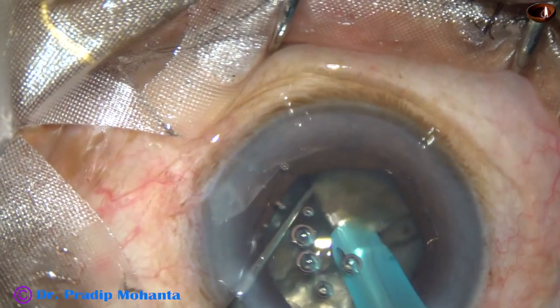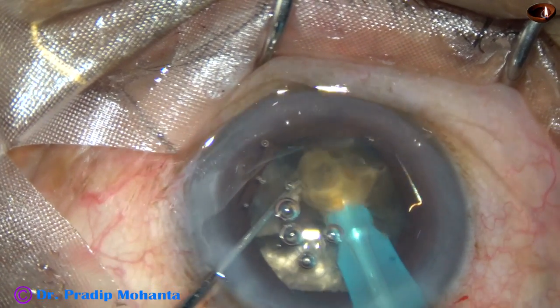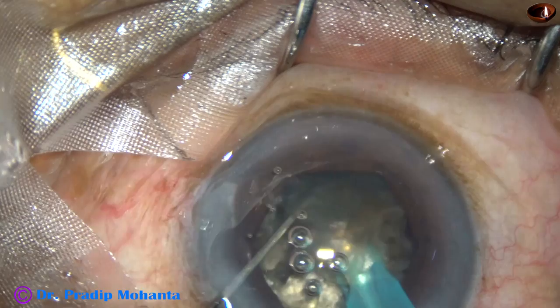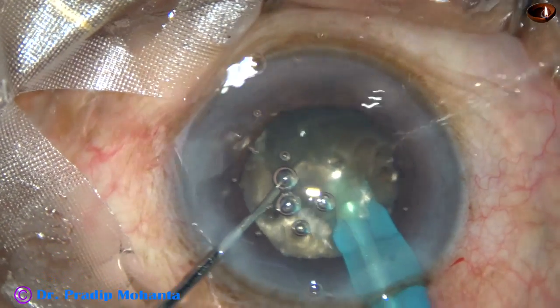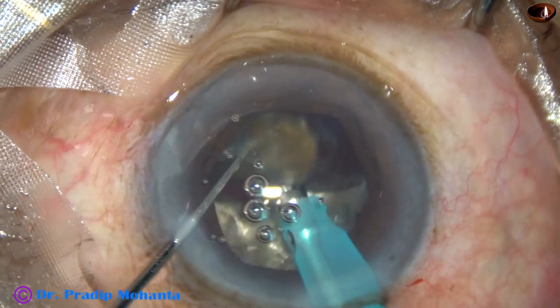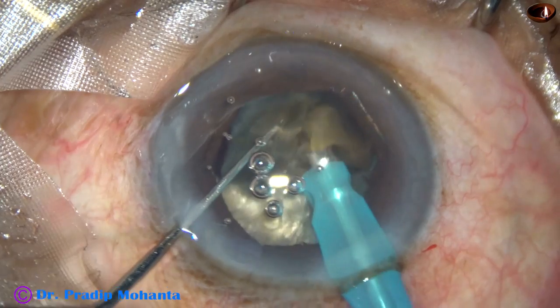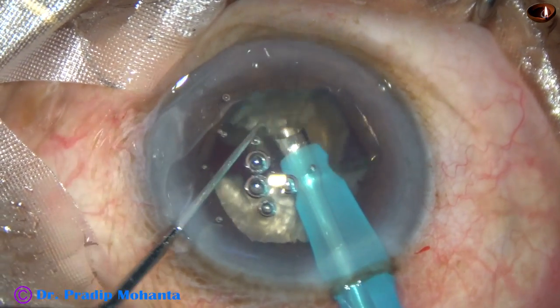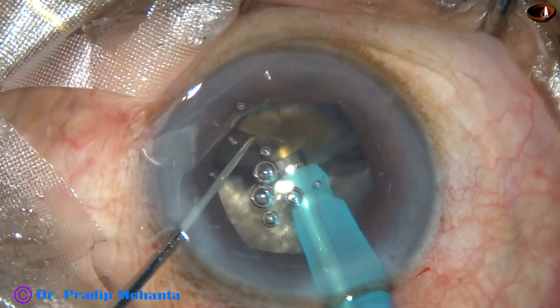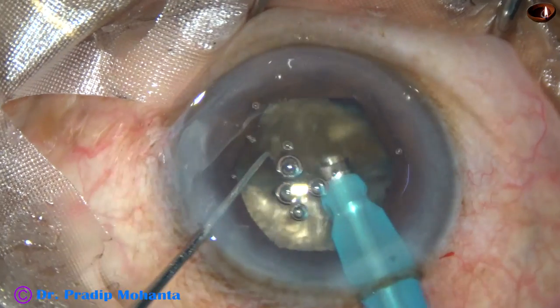We now have four large free fragments. Each large fragment is tilted and emulsification is started from the apex. From the very beginning we are in high-flow, high-vacuum mode. Flow rate is 45 ml per minute, vacuum is 450 mmHg, and ultrasonic energy used is 85%. This is the Sovereign phaco machine from Abbott Medical Optics.